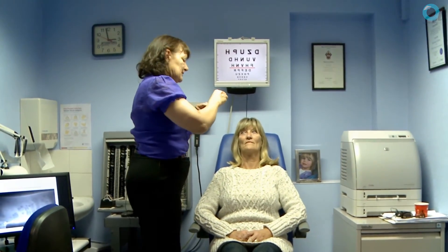I'm going to stain the patient with a combined stain of 1% fluorescein and lissamine green. Never use 2% fluorescein on a dry-eyed patient because it just won't fluoresce and you'll have to add saline to see anything. So I'm just going to put in this combined stain.